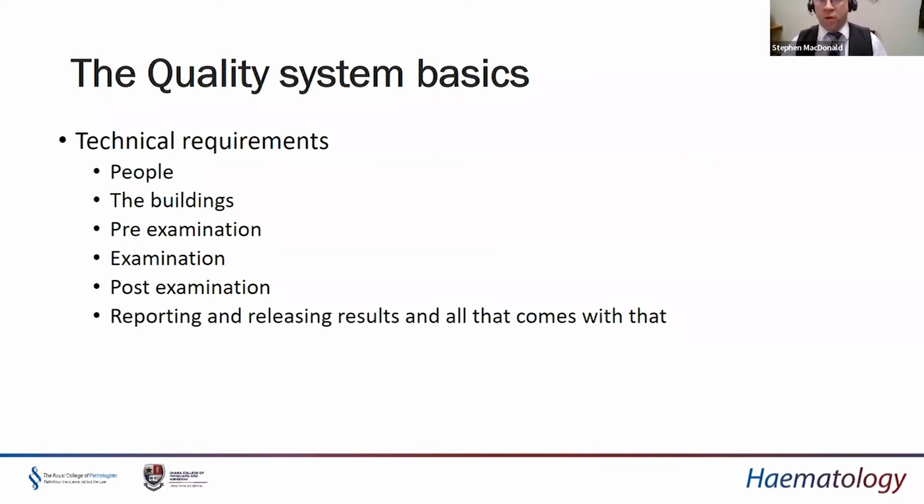So it's very important that the quality system manages all of that so that the results that are needed get to the right place.